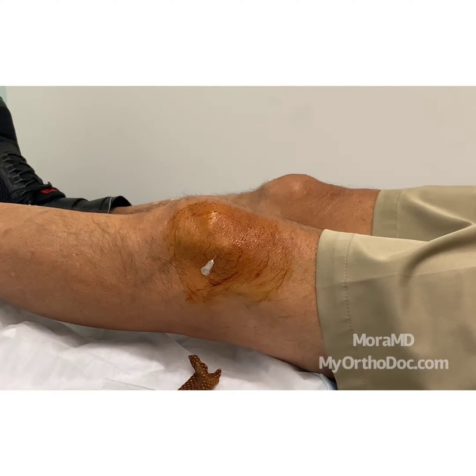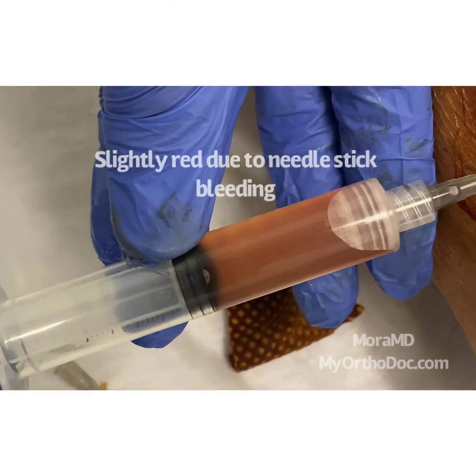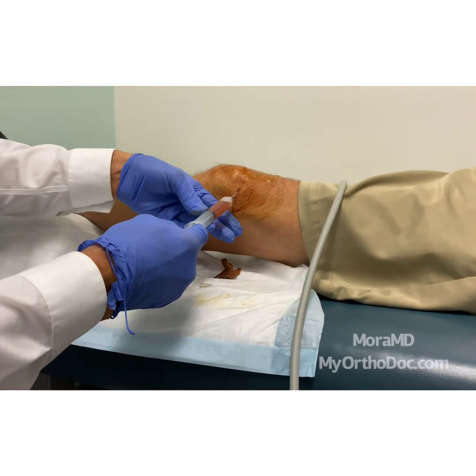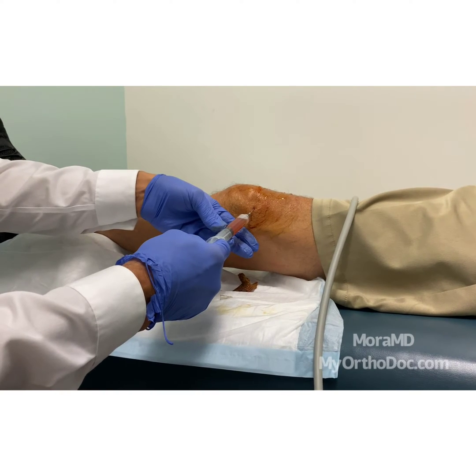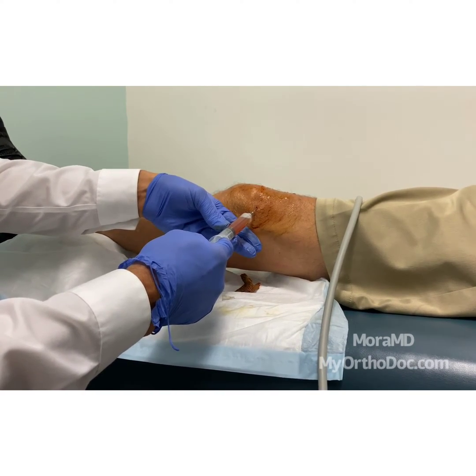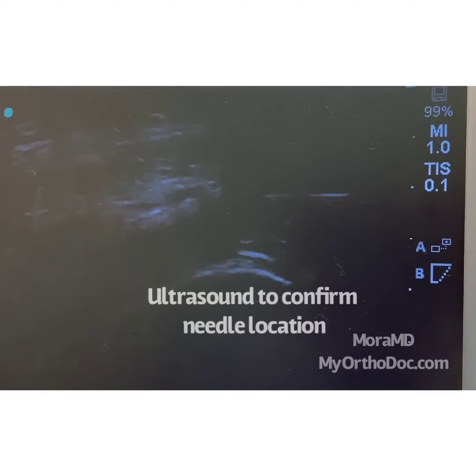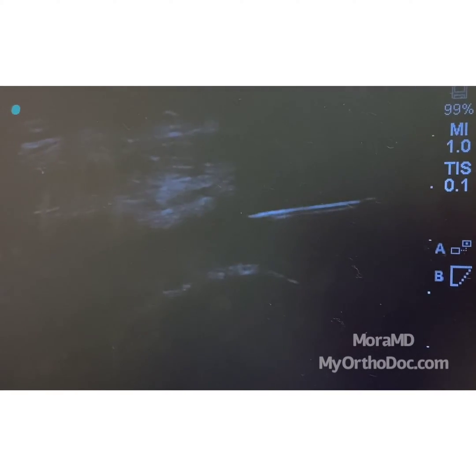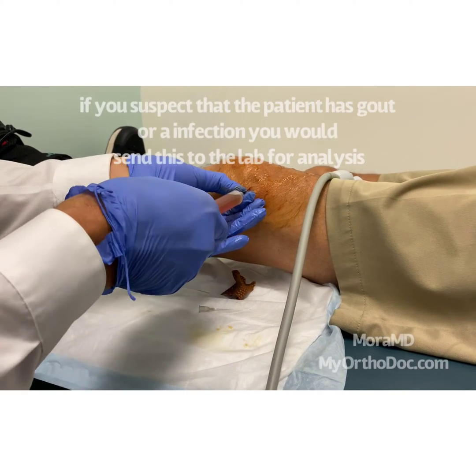It looks like normal synovial fluid, so I'm going to take this all out. I know I'm in the joint because if I wasn't, I would not be getting any fluid. With the 22-gauge needle in — after the lidocaine was initially put in — I checked my ultrasound. You can see I was heading towards the quadriceps, but now I'm going to head under the quadriceps. Clear as day, there we go.